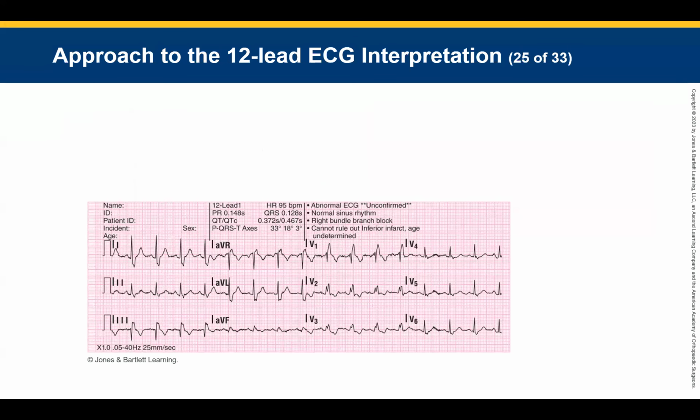We're trying to find things that could mimic a STEMI if we're trying to rule out a STEMI, but some of these are legit problems that they could have that we would just be finding, right? We're finding it, we're also saying, hey, that has chest pain, but it's not necessarily STEMI, even though it looks like it could. So we're doing 2 things. STEMI mimic, not necessarily a pre-hospital emergency, but an issue. Or maybe that we're going to treat part of it.